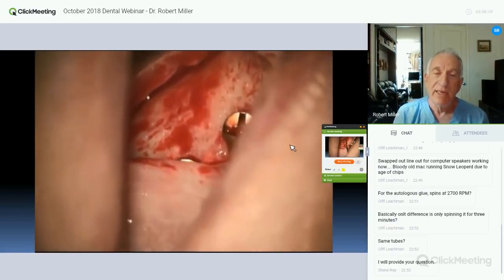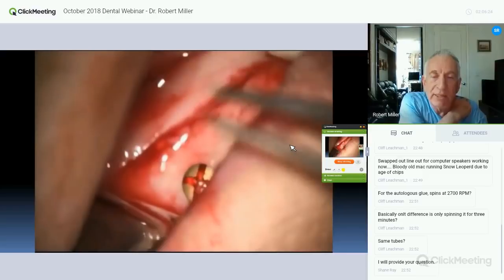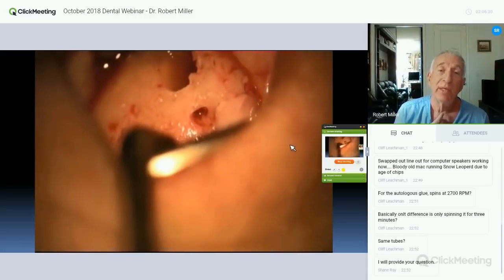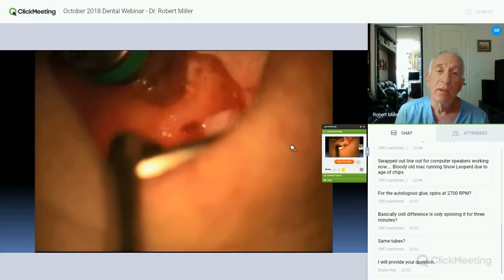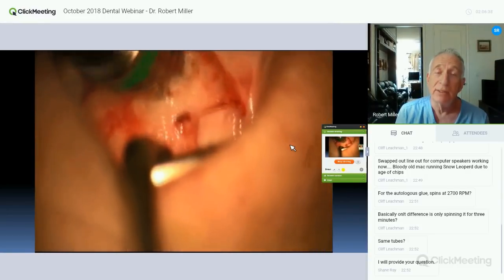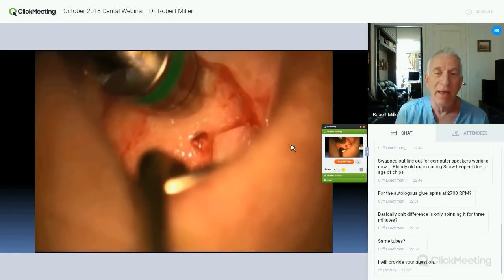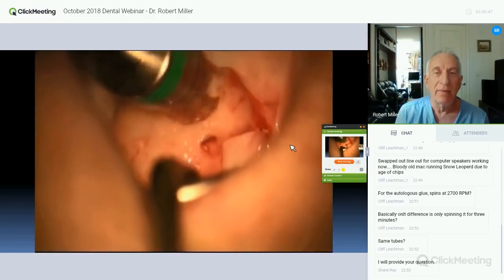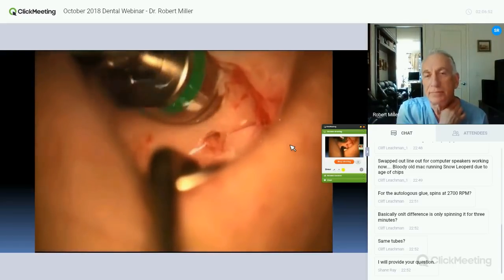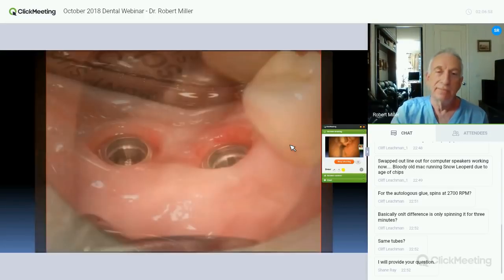And watch when I remove the tenting screws, look at the vascularity of that bone. Grafted bone, that's what you want to see. You don't want to see what looks like dead bone internally. When you remove that, look at the bleeding site. And then when I'm drilling my osteotomy, look at the vascularity. When I actually pull the drill out, you can see. Now, this is a grafted complex. And grafted complex, especially if you have a lot of graft material that's still there, still resident, you're not going to get a lot of vascularity. But watch when I pull the drill out. Look at that vascularity. That's grafted bone. That's what we want to see.